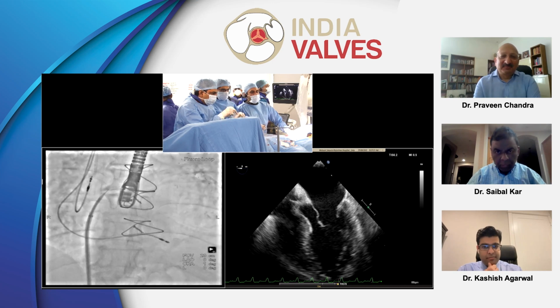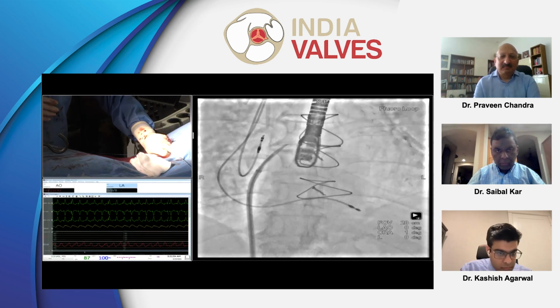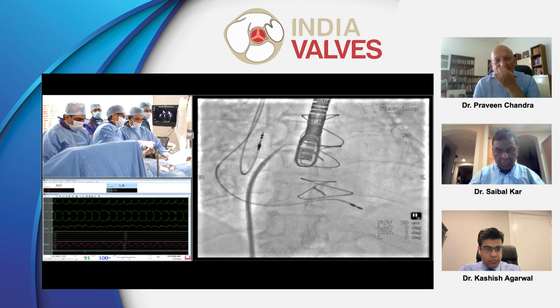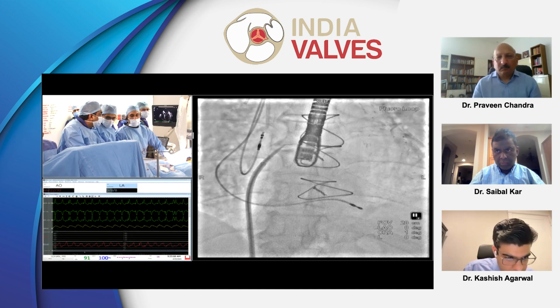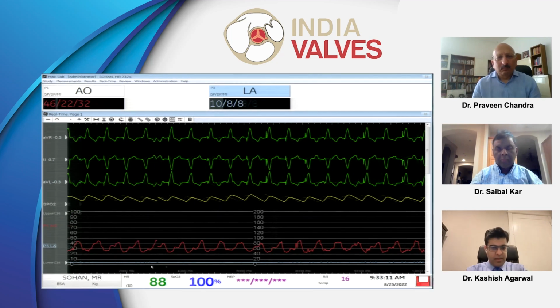So can you see the hemodynamic tracings? You can see the pressure which is coming from the pigtail in the LA. A large V wave of almost, let's come first. Come here. Don't worry. How high is the LA V wave? It's 45. Can you see on your screen? Oh, there. Yeah, that's nice.